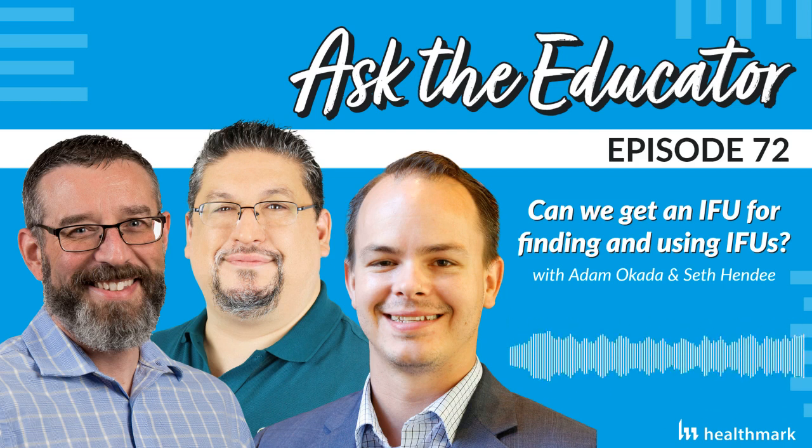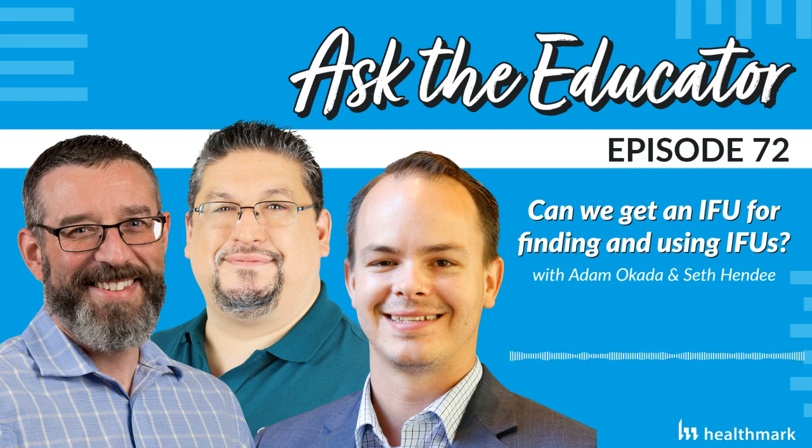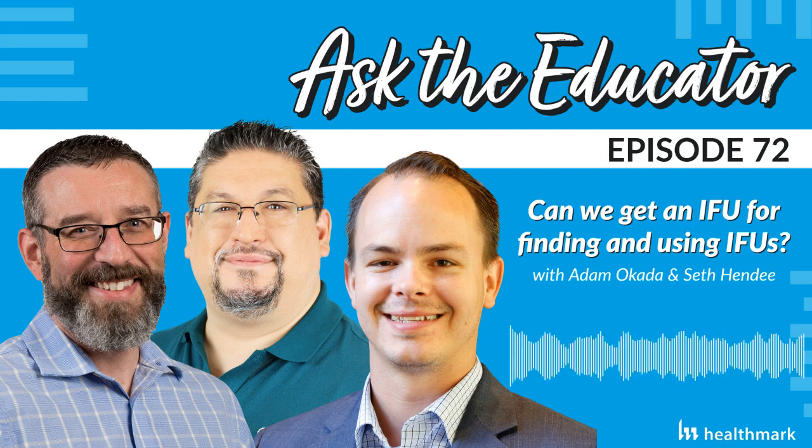And so we were looking through the IFU, trying to find, does it say immediate use anywhere, any type of shortened cycle, anything? And there weren't any. I called the robotic company. I said, "Hey, we can't find any IUSS instructions." And they were like, "Yeah, we didn't put any in." So if you don't have them, you really should not be IUSSing that specific thing. But you wouldn't know that unless you looked at the IFU.